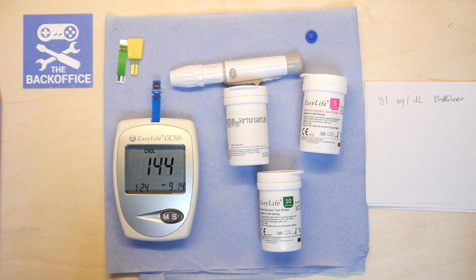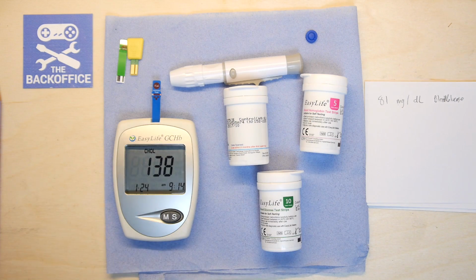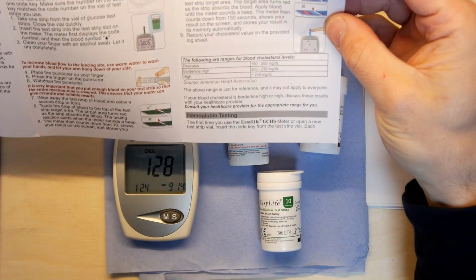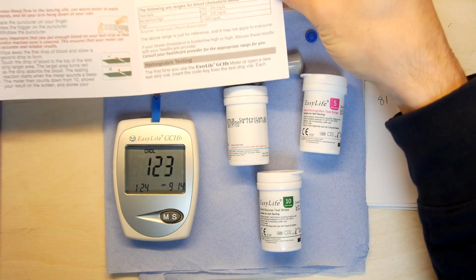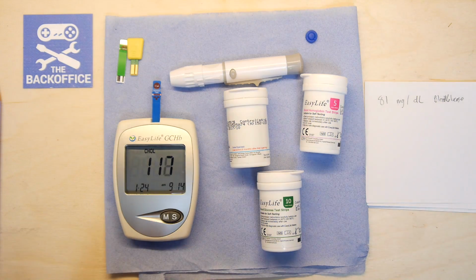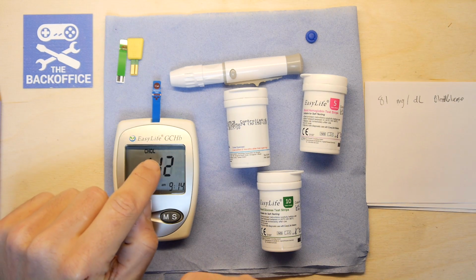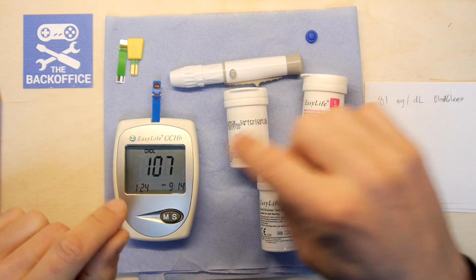Oh, it's going to take a long time to figure this bad boy out. It's thinking about it. Wow, that's a long processing time for this test. So I'm going to have a quick look at the gauge here to see what we're aiming for. So we're aiming between 160 and 200 if we're going to be desirable. Beyond that, then we'll worry about it. So that's quite a while for it to wait. It's a shame in a way because I just noticed it says cholesterol on the screen. That's cool. It says glue HB col, so cute.